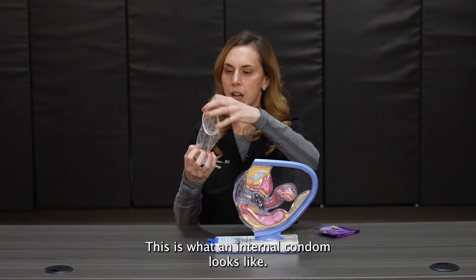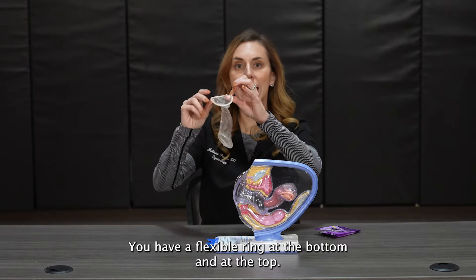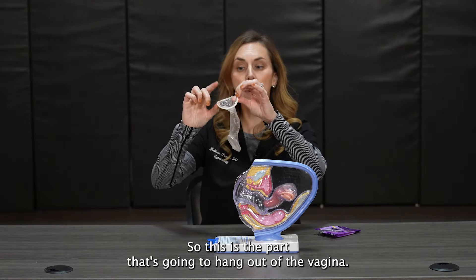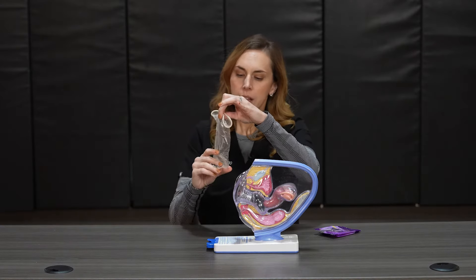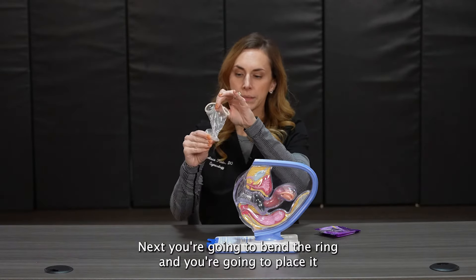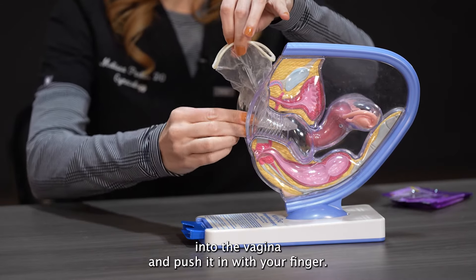This is what an internal condom looks like. You have a flexible ring at the bottom and at the top. This is the part that's going to hang out of the vagina, and this is the part that goes into the vagina. Next you're going to bend the ring and place it into the vagina and push it in with your finger.